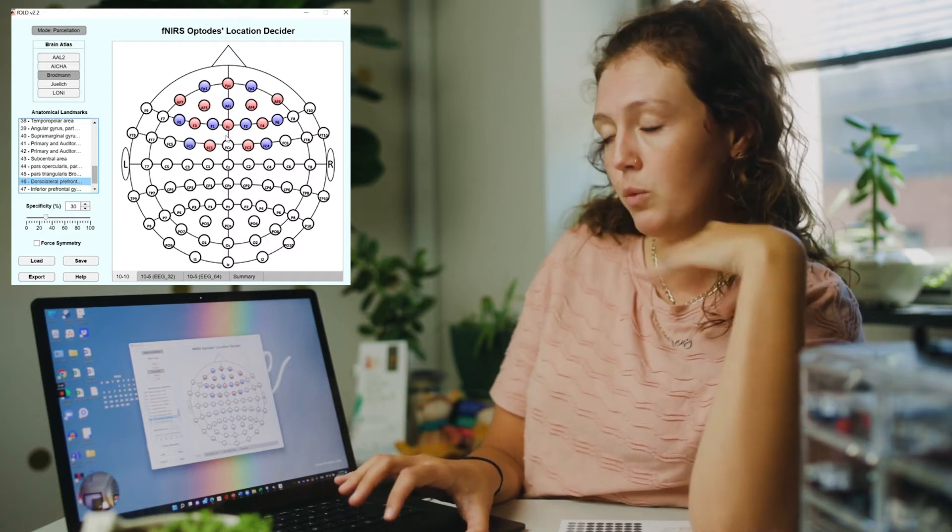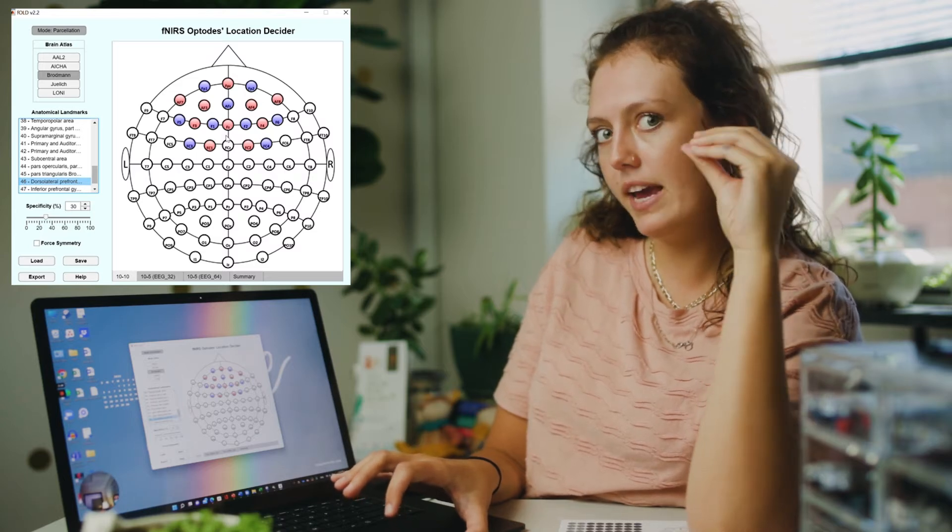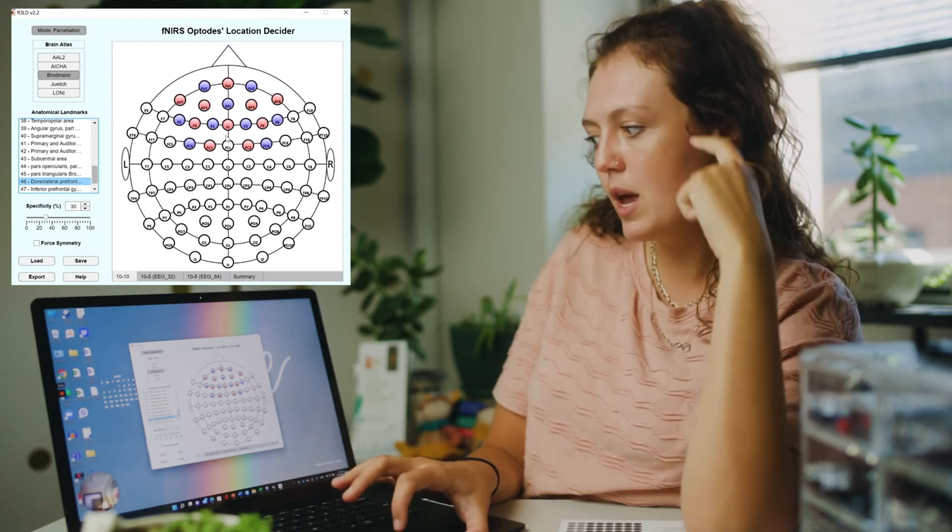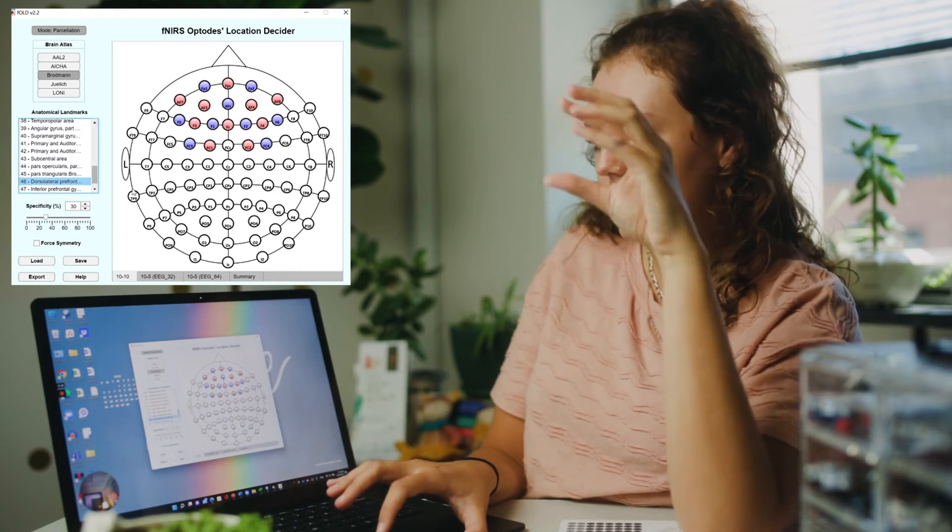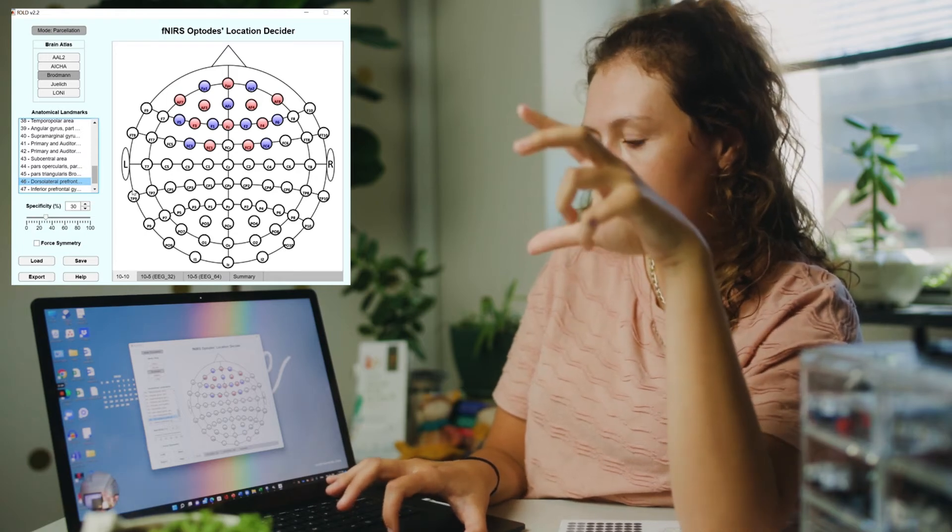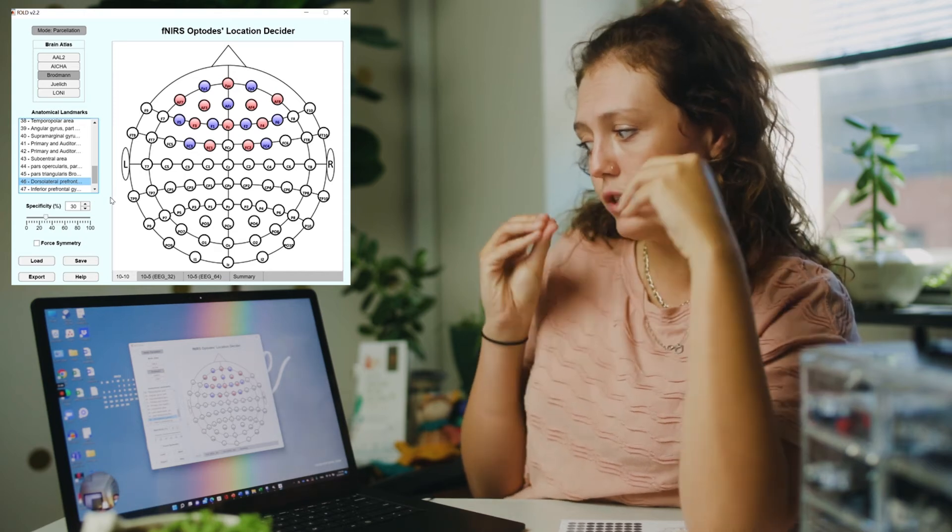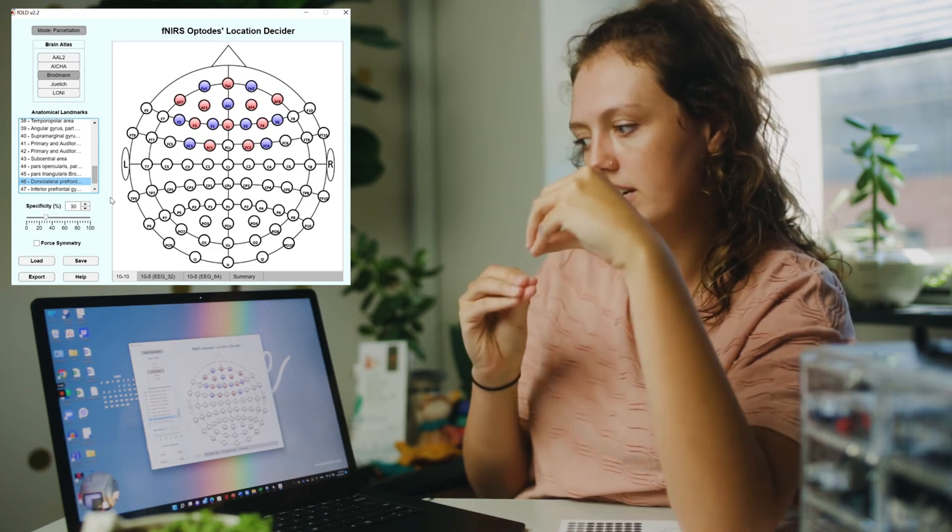Now, as you can see, my FNIRS machine only has an 8x8 configuration, meaning I only have 8 sources and 8 detectors, but we have more than 8 sources and 8 detectors here. So we need to adjust the specificity higher so we lose some of these channels or sources and detectors, but we're still accurately covering the anatomical region of interest.